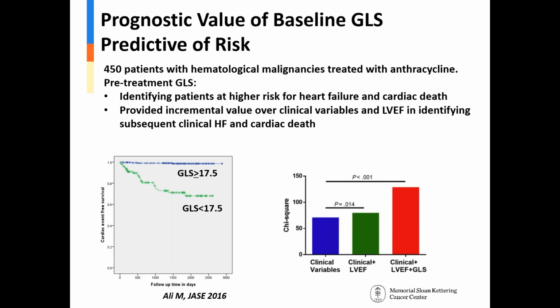And in general, of course, we recommend referring the patient to the cardio-oncology clinic, but sometimes a patient has a previous echo that was performed before the cancer diagnosis, and there are some changes in ejection fraction or even in strain that are not related to any special issue, and depend on the variability between one echo and the next. So it's very important to review previous studies before finalizing the current echo report, and to explain to the oncologist what the changes that we see mean.